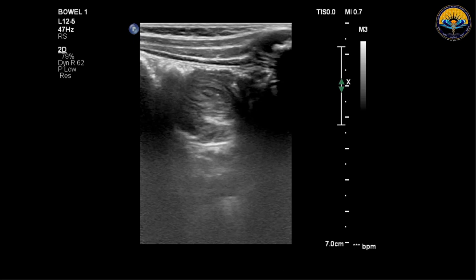So before I say anything, I will just show you this video. Just go through it. There are multiple interesting signs that can be seen in a case of intussusception, and I would like all of you to go through this video. It is a 30-second time-lapse video with various loops stitched together during the procedure of hydrostatic reduction of the intussusception.